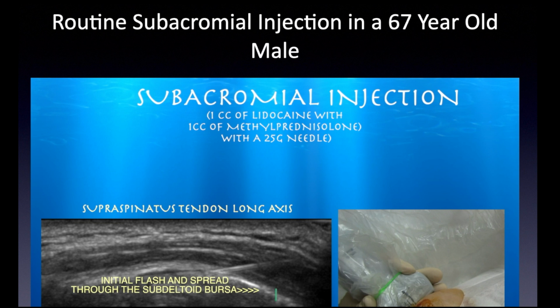But I have seen probes going around with little blood residue on them from other doctors that cover the probe. And if it was me and I knew the patient before had blood on the probe, and now they're going to do an injection on me with that probe and put that on my skin and then stick me with a needle, I just wouldn't feel comfortable with that. Now, if you clean the probe, what are the chances of actually transmitting, God forbid, any kind of disease? I think it's very low, but I think it's basically almost zero if you cover the probe every time.